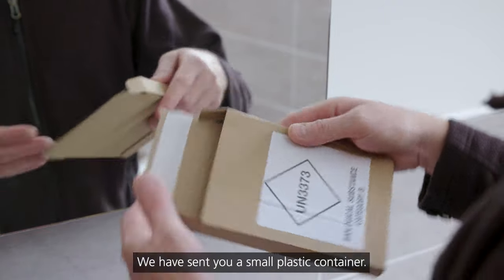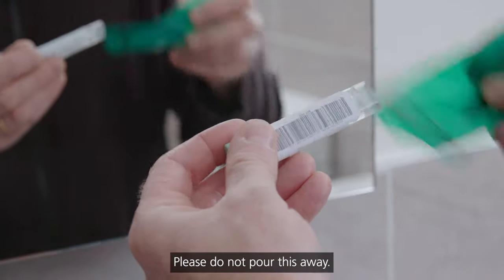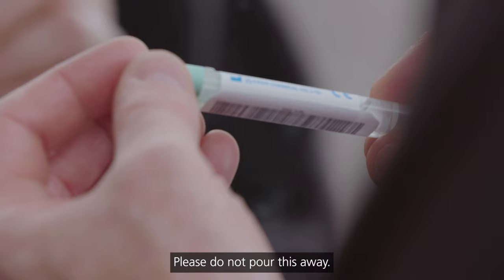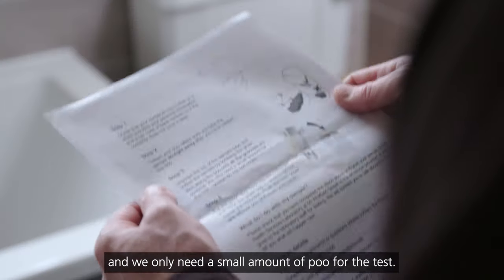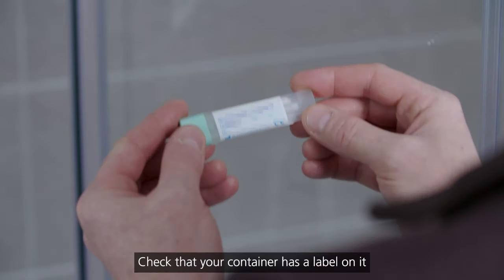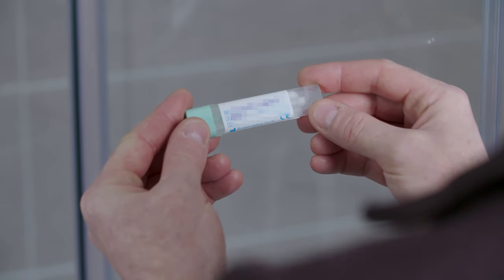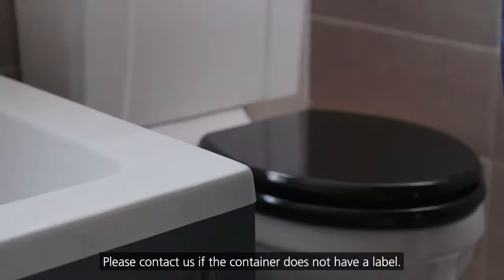We have sent you a small plastic container. This contains liquid preservative — please do not pour this away. Collecting your sample is very simple and clean, and we only need a small amount of poo for the test. Check that your container has a label on it which includes your personal information and a barcode. Please contact us if the container does not have a label.